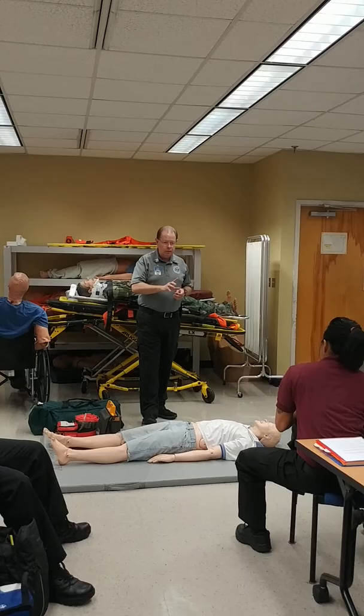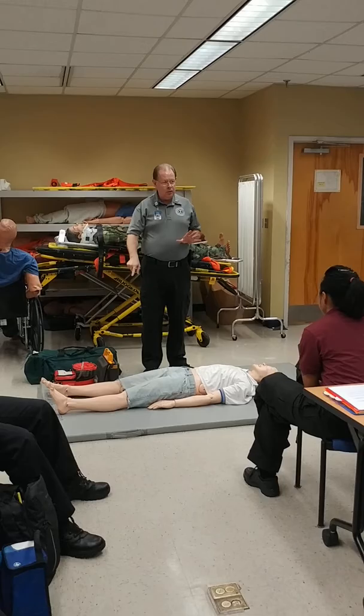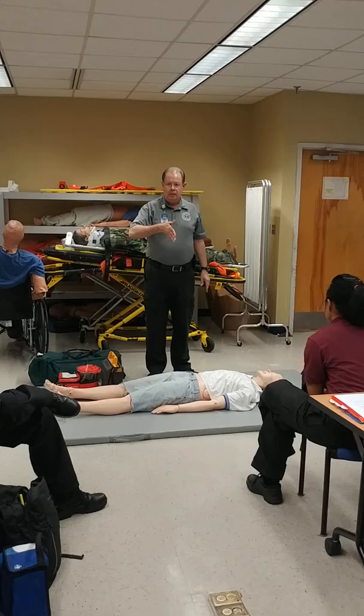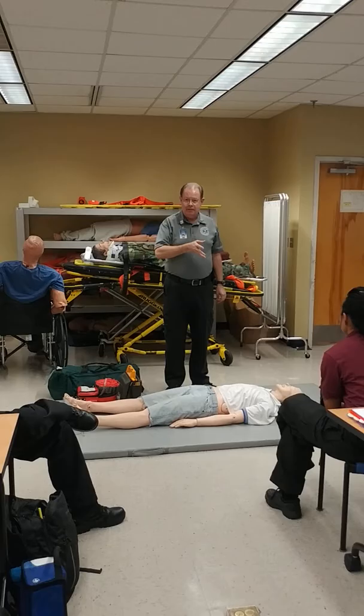Two minutes runs out, and during that time we should have the King airway ready. But don't drop it in right away, because we stop everything to analyze, then charge, then shock — so that patient needs oxygen. At about the one-minute mark of the two minutes, with one minute of ventilations in, now I can drop the King. You'll need about a minute to place it, confirm placement by checking lung sounds, and secure it with the tube holder.